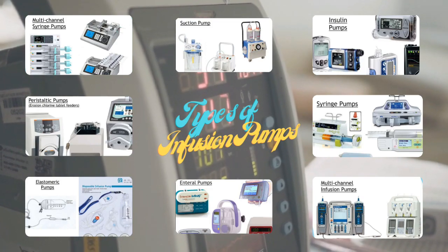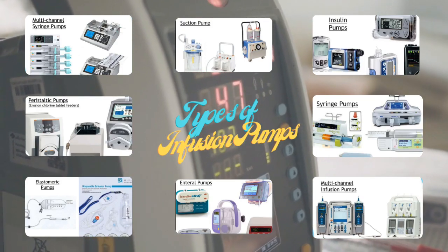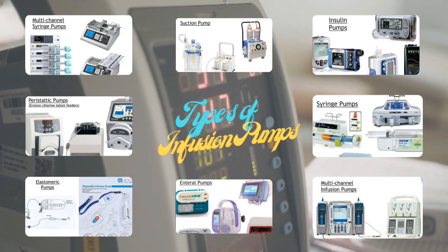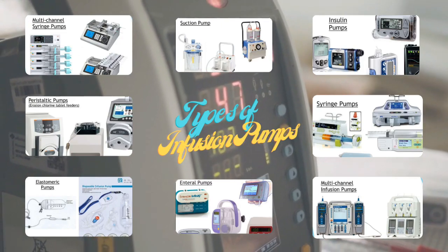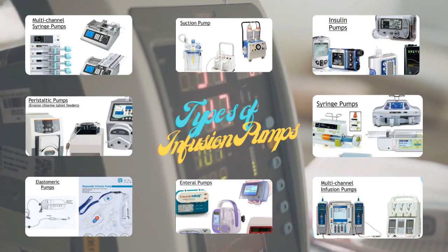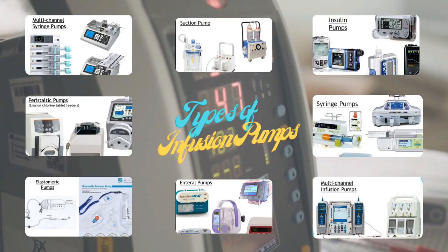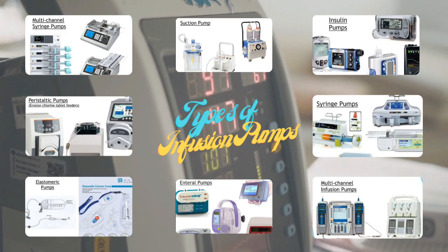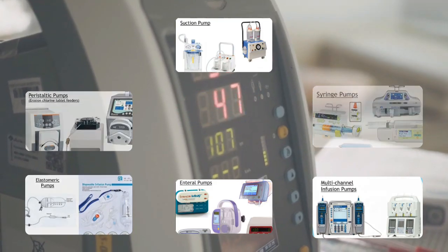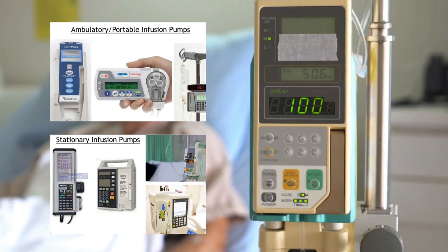Traditional infusion pumps can be used in medical settings such as mobile, home, and long-term care. These pumps can be used to give pain medication, antibiotics, chemotherapeutic medication, and hydration fluids in both fixed and mobile settings. For example, syringe infusion pumps, disposable pumps, large volume pumps, and elastomeric pumps. Classified by their mobility, infusion pumps are divided into two: ambulatory infusion pumps and stationary infusion pumps.